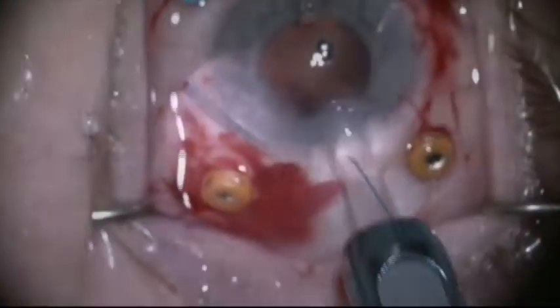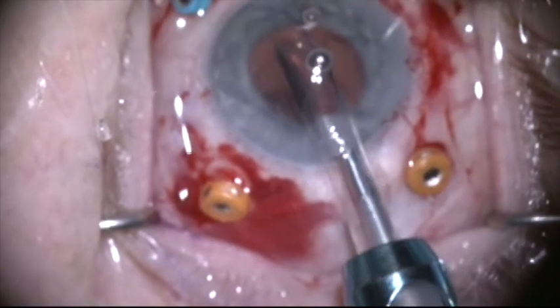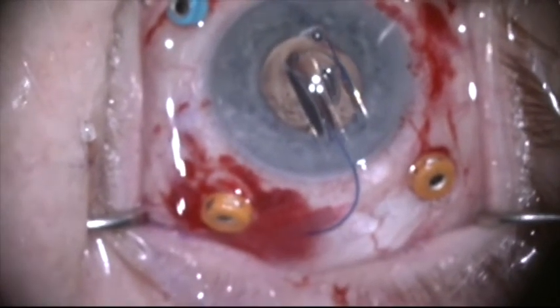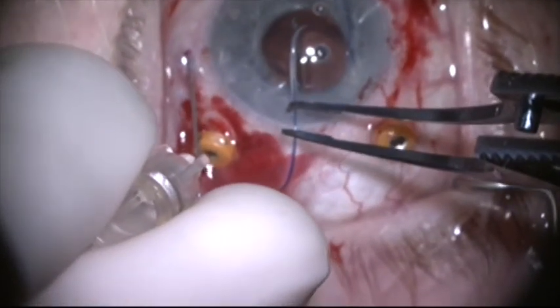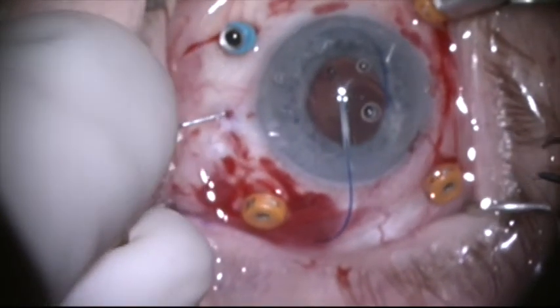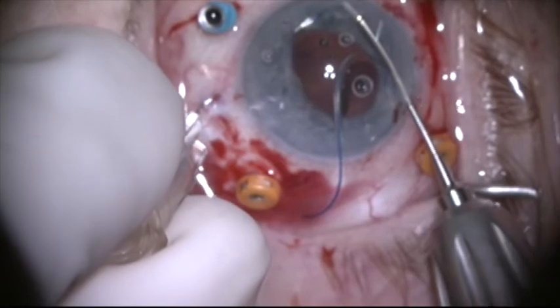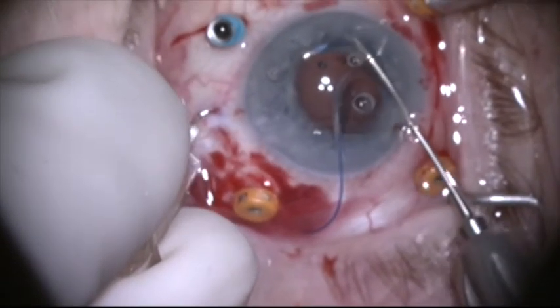I can now go about the business of putting the new lens in. This is an Arant EC3 PAL three-piece lens I'm injecting with a shooter into the anterior chamber. The lens is unfolding. Now I'm going to use a 30-gauge TSK needle about 1.5 to 2 millimeters posterior to the limbus, entering at an angle that mimics the curvature of the haptic. I'm going to grab the haptic with a 25-gauge MST micro forceps and feed it into the lumen of the 30-gauge needle.